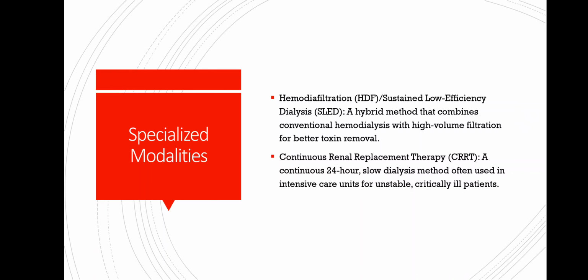Then specialized modalities of hemodialysis. First one, hemodiafiltration, HDF, or sustained low efficiency dialysis. It is also known as SLED. It's a hybrid method that combines conventional hemodialysis with high volume filtration for better toxin removal. Another main type of special modality is CRRT.